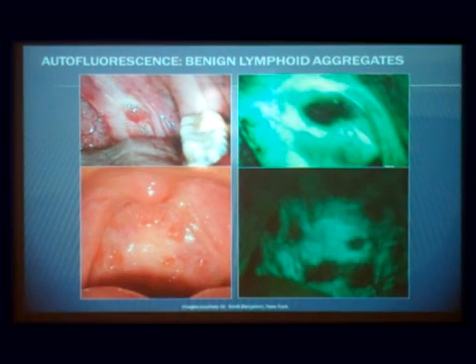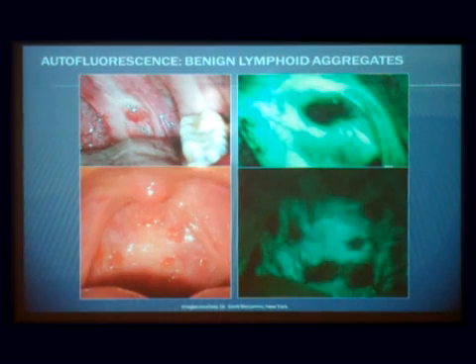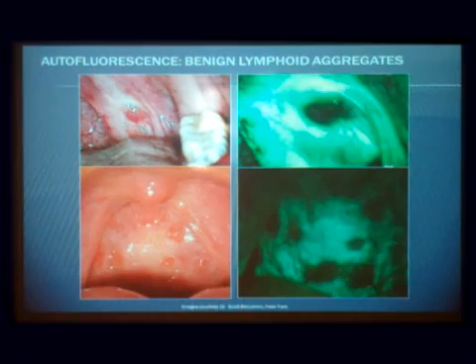So what you have to do, especially if you get a rounded look to it, is use the regular light and go off to one side and another and try to get the three-dimensional aspect of it. And also this has almost a translucent look to it, where regular dysplastic cells would not do that. So there are ways of looking at it, but there again, you have to use your head. You can't just use the test to do your thinking for you.